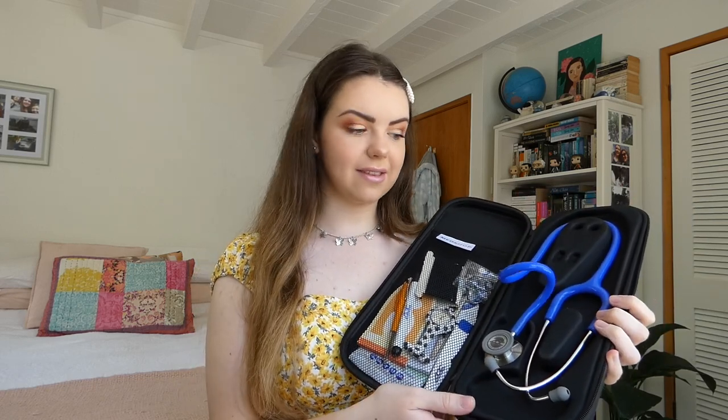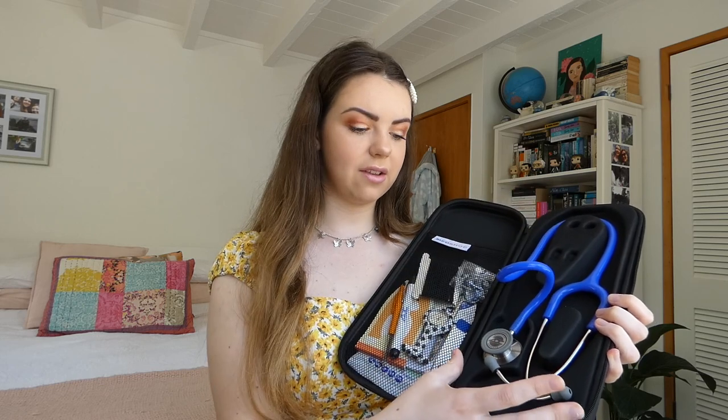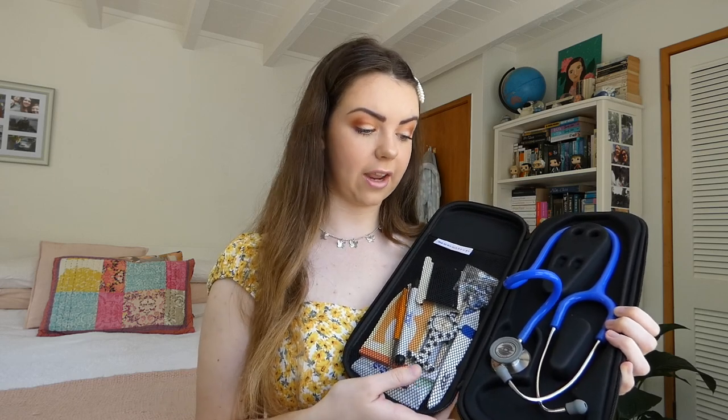This is what it looks like on the inside. On this side it's just for your stethoscope — it's got little indents in here for your stethoscope earpieces and replacements. On this side it's got a little pocket for whatever other essentials you want to carry. So I'm going to go through everything in this case.